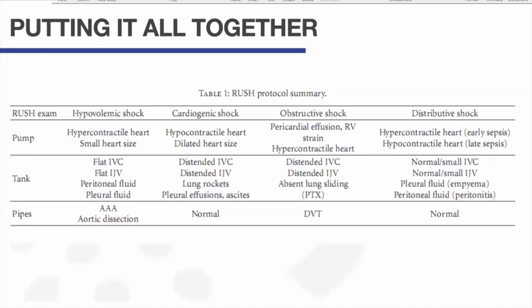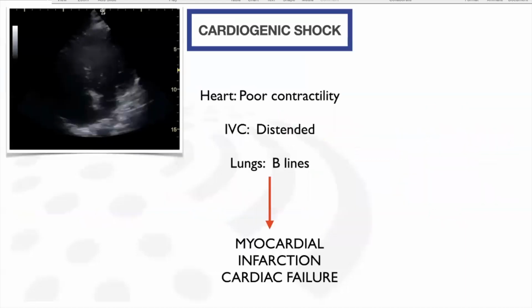On assessment of the tank, you may find pneumonia as the cause of the sepsis, or empyema, or even free fluid in the peritoneum suggestive of peritonitis.